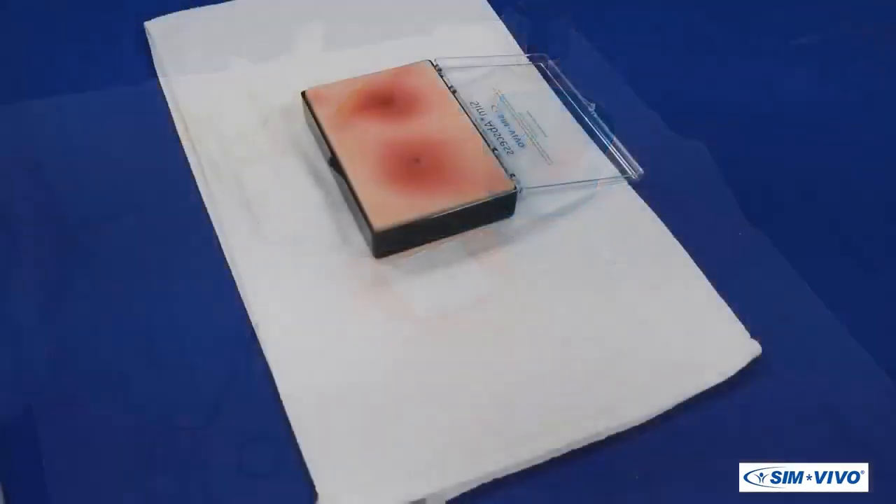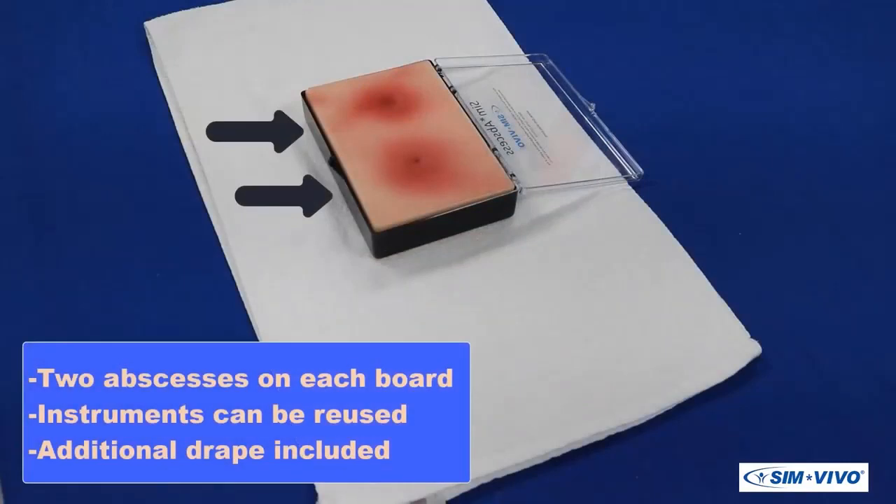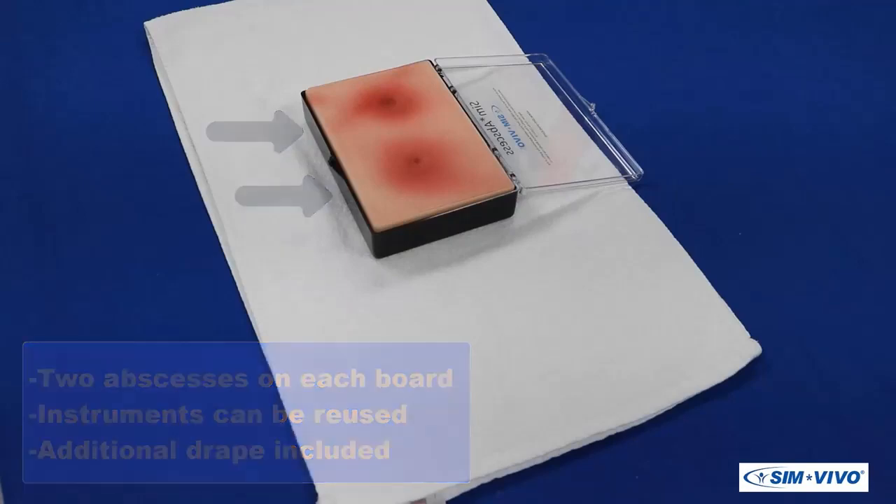Since two abscesses are on each board, this procedure can be practiced again. Materials and instruments will be assumed to be re-sterilized and available for the second procedure.